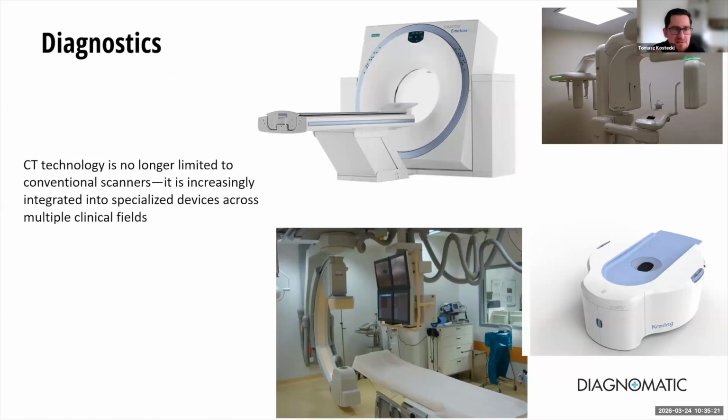CT technology is no longer limited to conventional scanners. It is increasingly integrated into specialized devices across multiple clinical fields. In the image, you can see a standard CT scanner, a dental CBCT scanner, a C-arm with integrated CBCT, and a new device, a breast CBCT scanner.